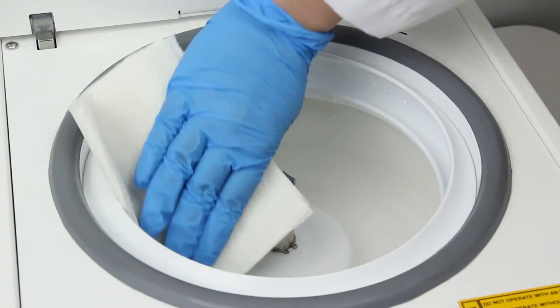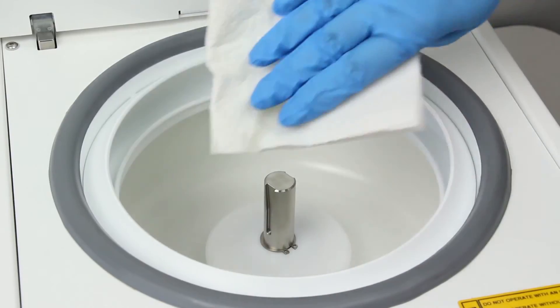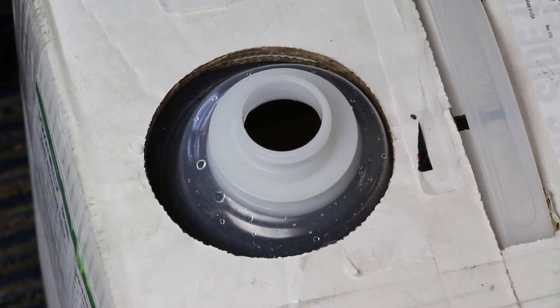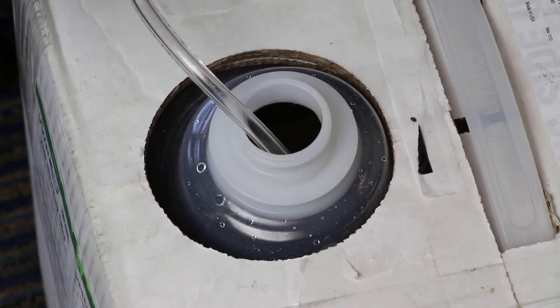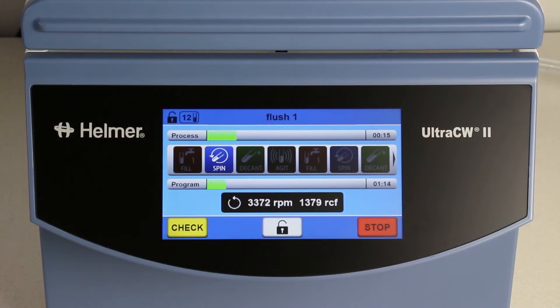Open the cell washer and dry the inner lid and inside the bowl area. Remove the saline tube from the deionized or distilled water container and place it in the saline solution container. Select and run the FLUSH-1 program.